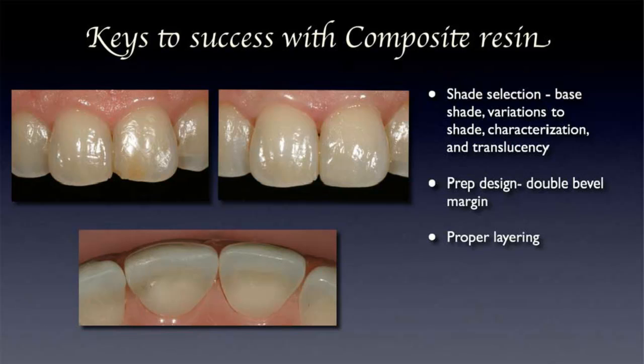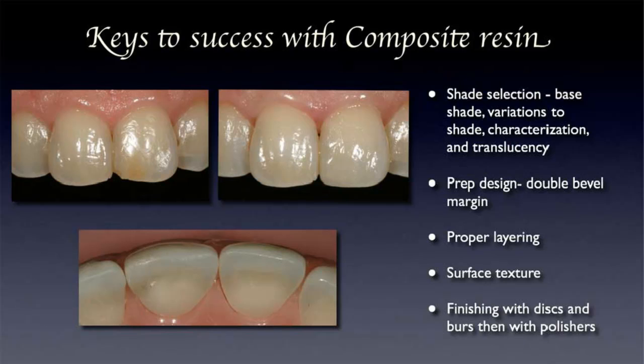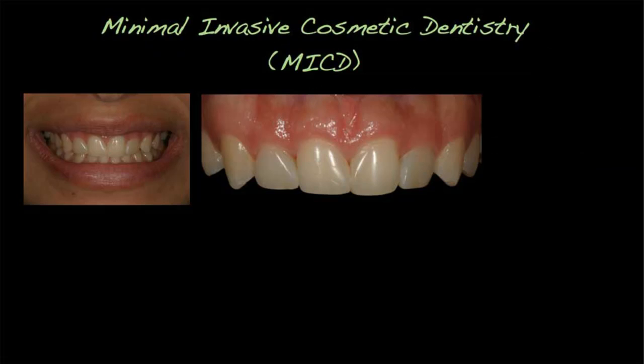And once you get to that point where you feel very comfortable with composite resins, you're able to get to a point where you can now build composite resin veneers. Now this is a before, this is old direct composite resin veneers, and then from there you're able to create beautiful restorations like this with your own hands. This is with a combination technique that I use with laser gingival sculpting. As you can see here how I lengthened these teeth, because underneath the composites were a lot of diastemas and a lot of small narrow teeth, so very large spaces interproximally that were closed up.